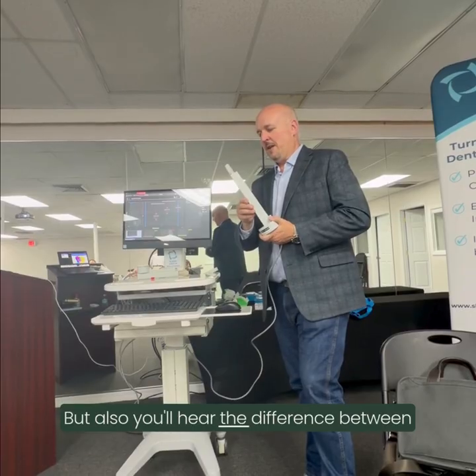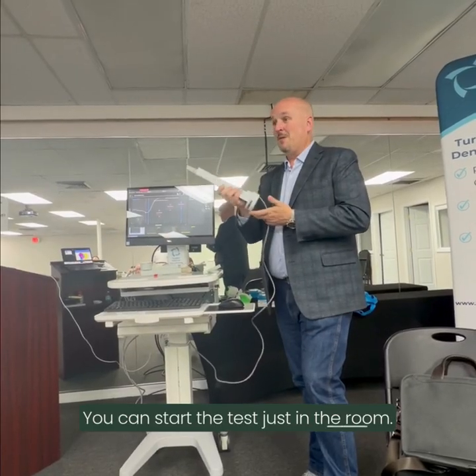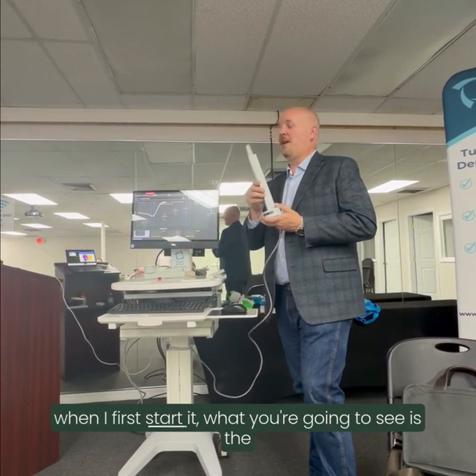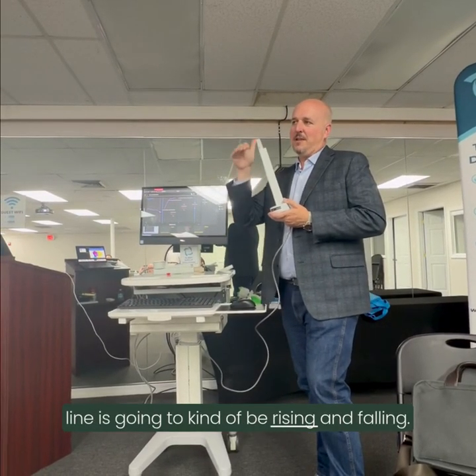But also you'll hear the difference between a poor seal and a good one. You can start the test just in the room. It doesn't matter. You can start it out here. And then when you hold it up to their nose, when I first start it, what you're going to see is the line's going to kind of be rising and falling.